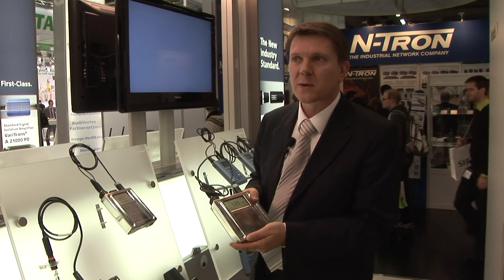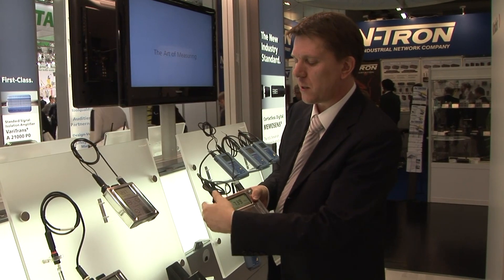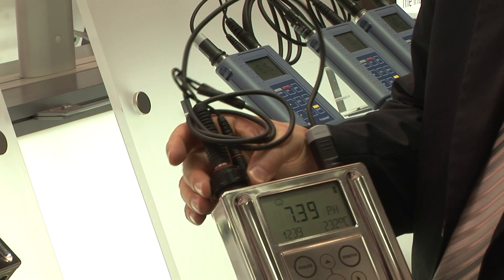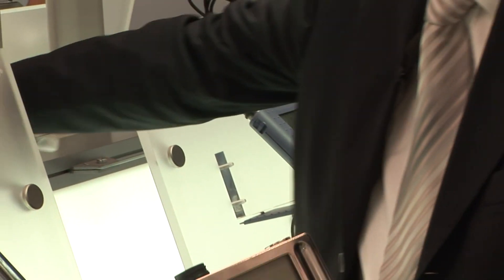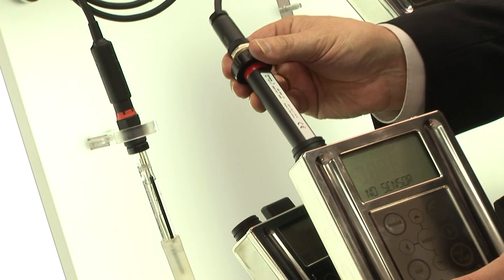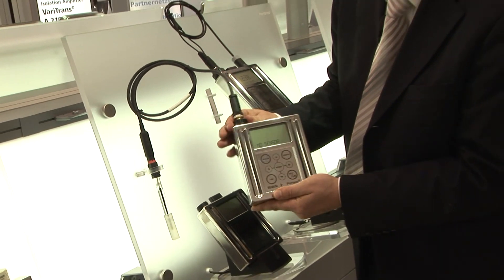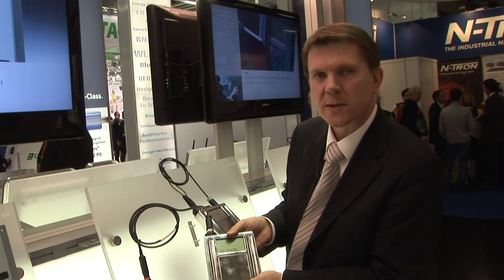Something else which is very important to this new Portavo S is the modularity with analog and digital sensors. We can easily replace the analog module by unscrewing it, taking it apart, and replacing it with a new digital module, which will make contact with memosense sensors and give you the possibility to use the new Portavo S as a complete calibration station for digital sensors.